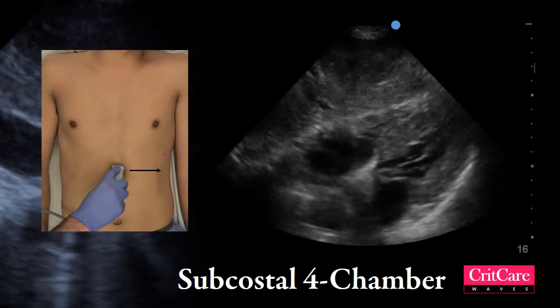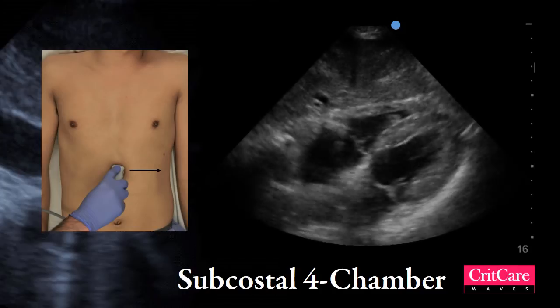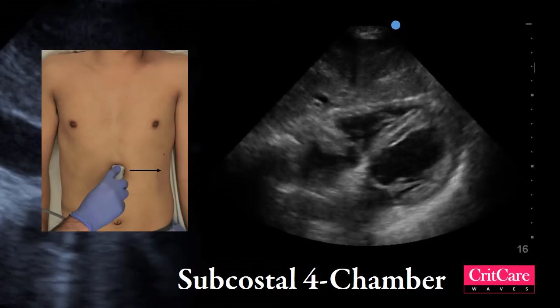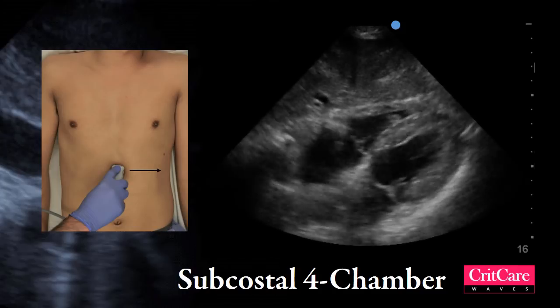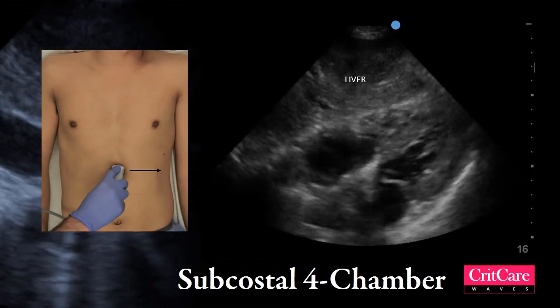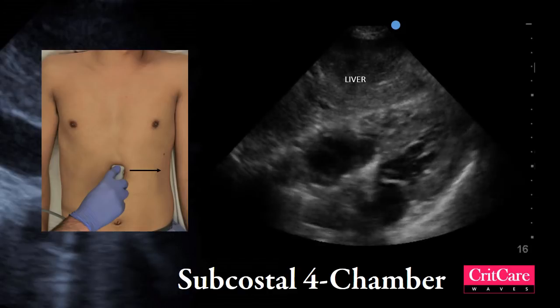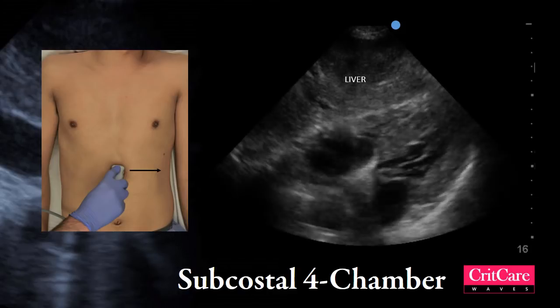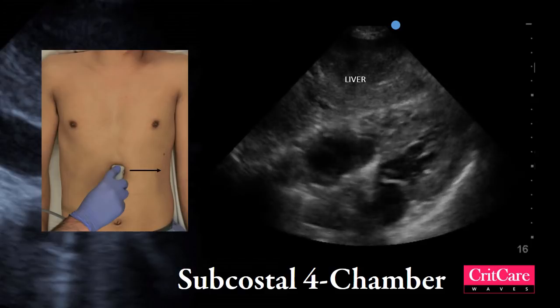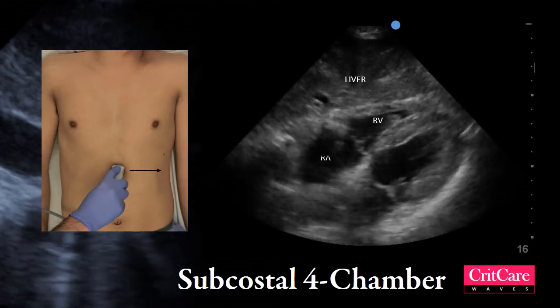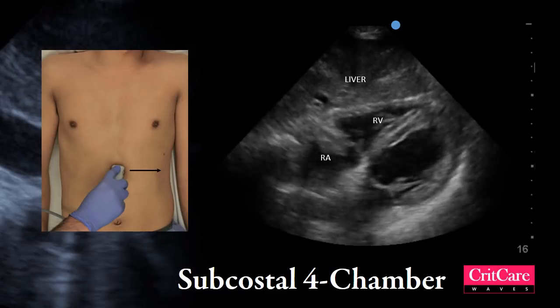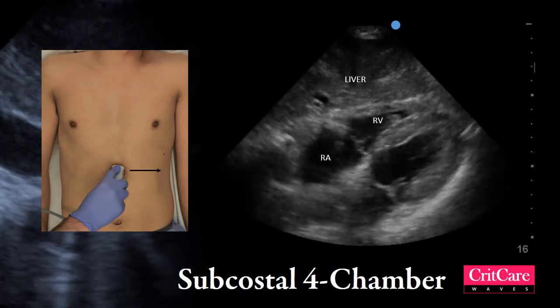A subcostal 4-chamber view is shown in the video. This homogenous echotexture is the liver. Since this is a vascular organ, the heart is visualized through the liver well. The two structures closest to the liver are the right heart structures — the right ventricle and the right atrium. The tricuspid valve can be seen between the right atrium and ventricle.